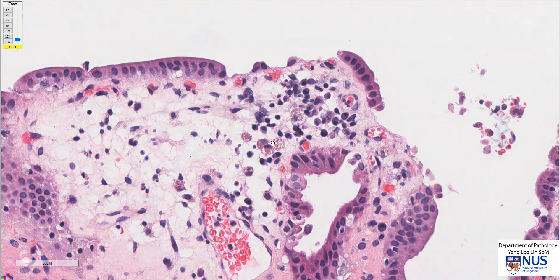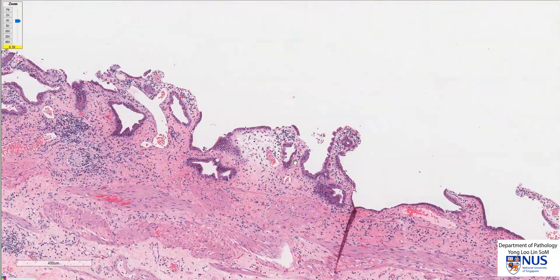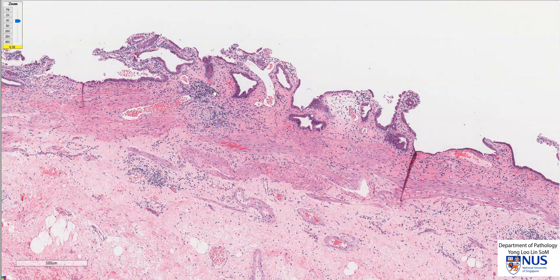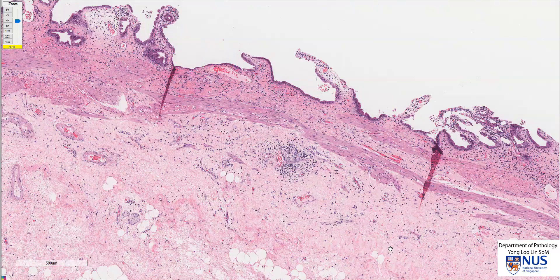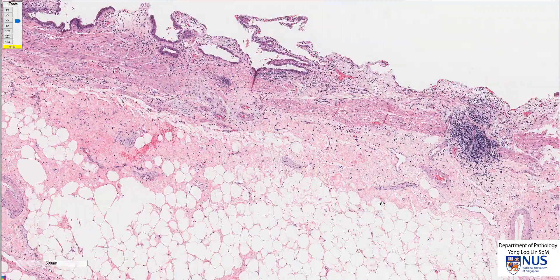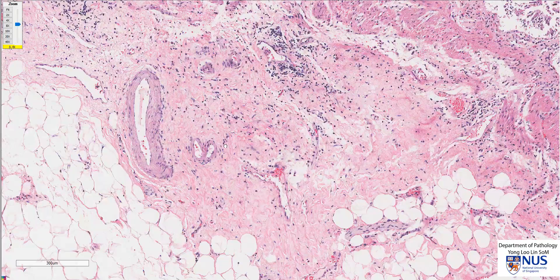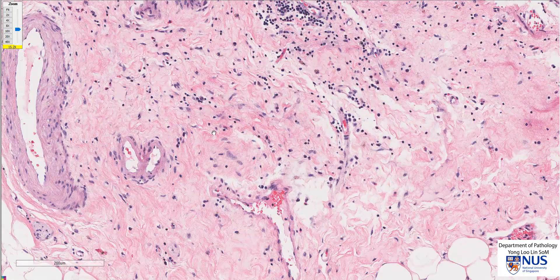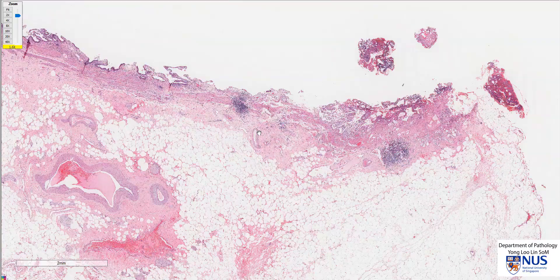We also see scattered macrophages, which have much more abundant cytoplasm. These chronic inflammatory infiltrates extend into the muscle layer and also focally into the subserosa. The subserosal tissue shows increased pinker areas composed of collagen, and you can see this more clearly here with these pink wavy collagen fibers.